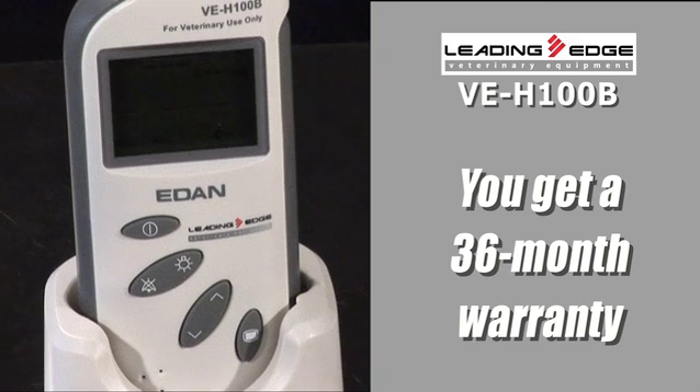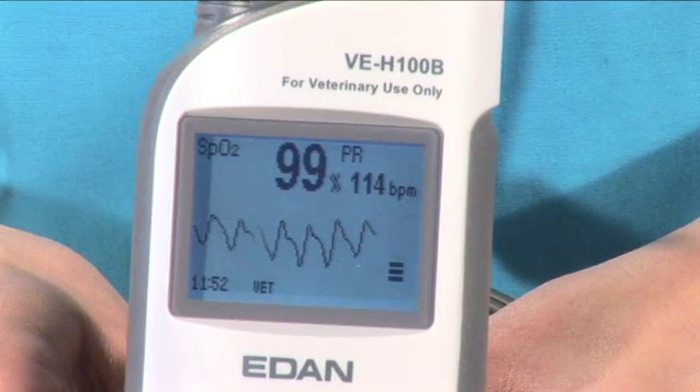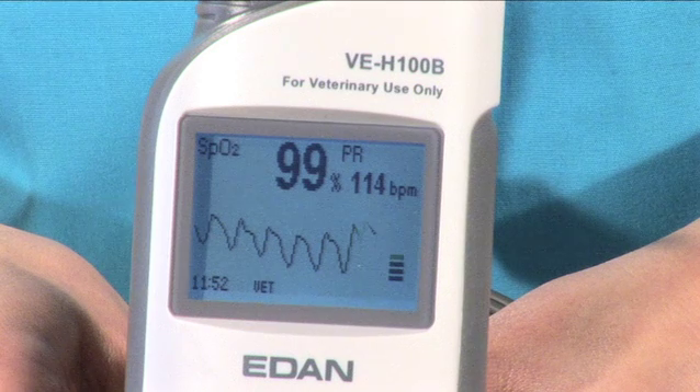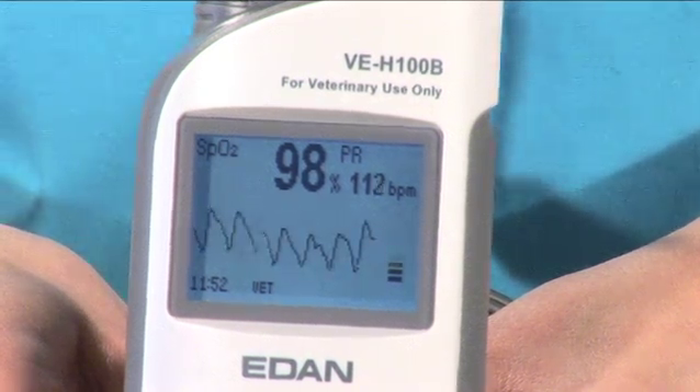First, a 36-month warranty, plus a full plethysmographic waveform in full view right on the LCD display — something only available in other multi-parameter monitors costing several thousands of dollars more.